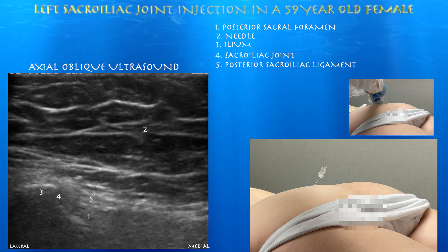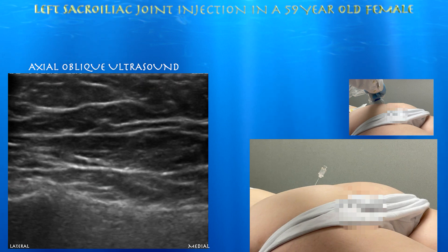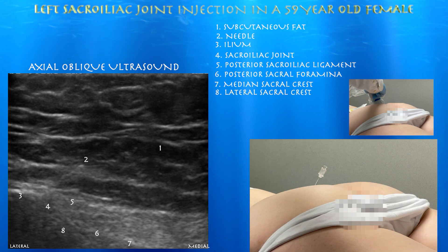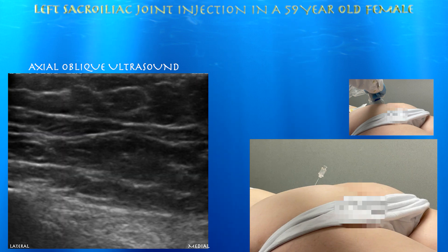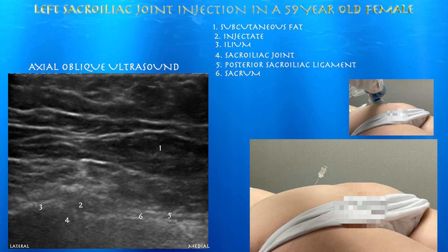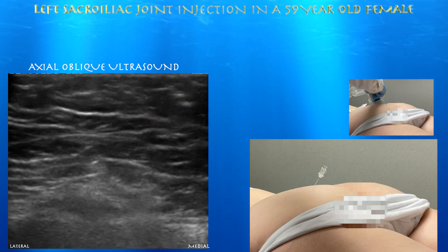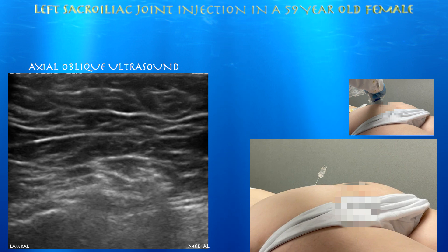Depending on where your probe is, you may or may not catch those posterior sacral foramina. You can see the needle going right towards the edge of the ilium at the articulation with the sacrum. You can also make out the lateral sacral crest in addition to the median sacral crest. Now we're starting to inject — you can see echogenic material essentially filling up that sacral iliac joint space and expanding, going upwards and downwards into the joint. You can see a blush of air at the end of the procedure, with injectate overlying the sacral iliac joint.